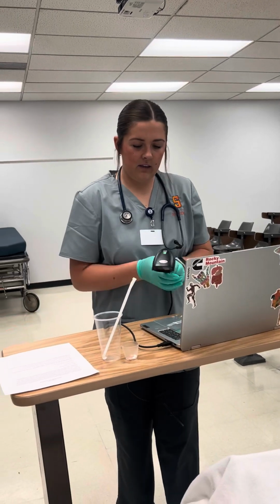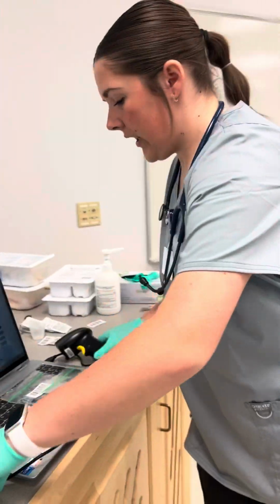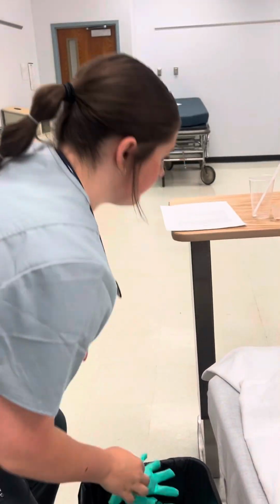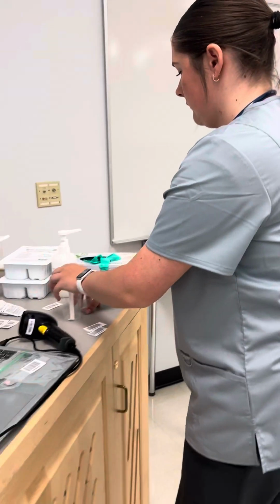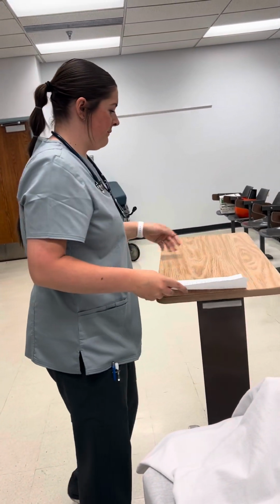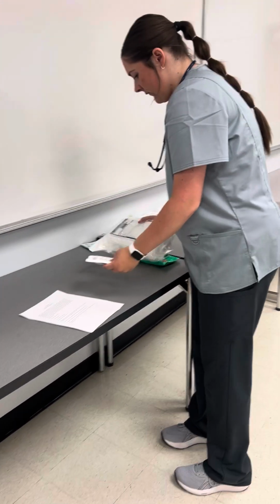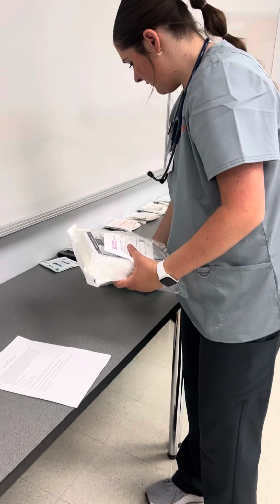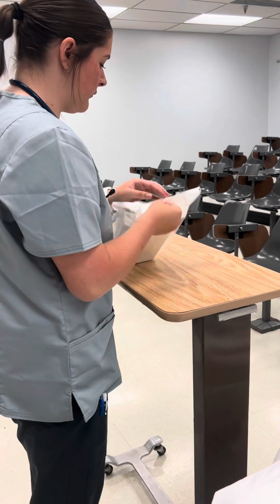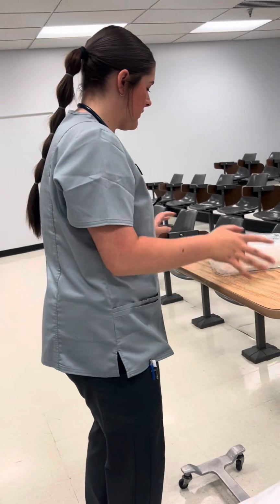So now that I have given my medications, I am going to get ready and place the Foley catheter for my patient. Okay, and the first thing I'm going to do is I'm just gonna write this all down, make sure it's all clean, and I'm gonna gather my supplies, which is my Foley catheter kit, gonna just bring this into the room.